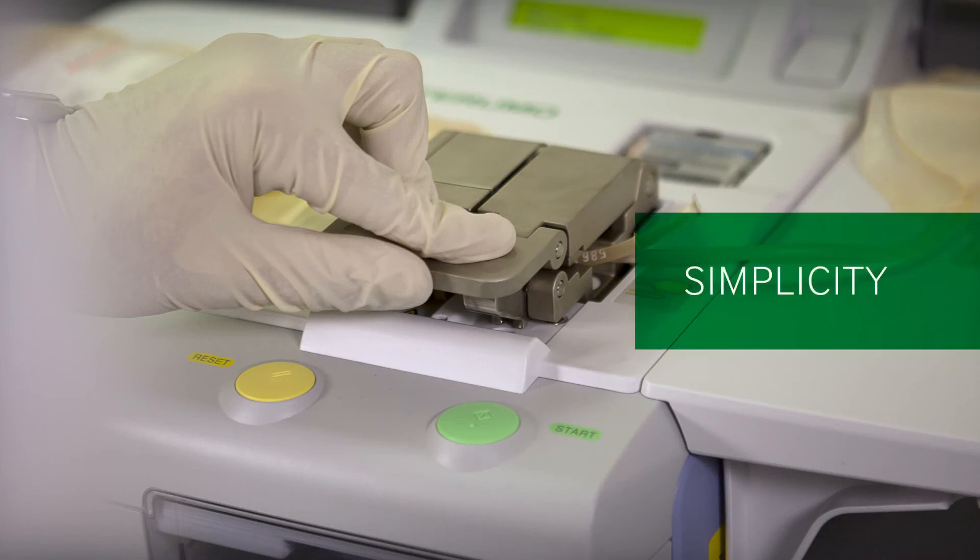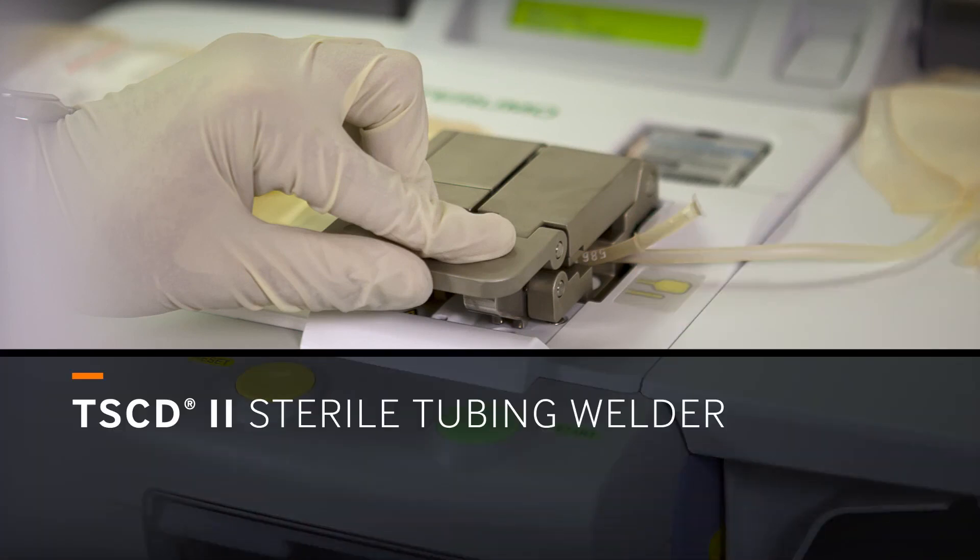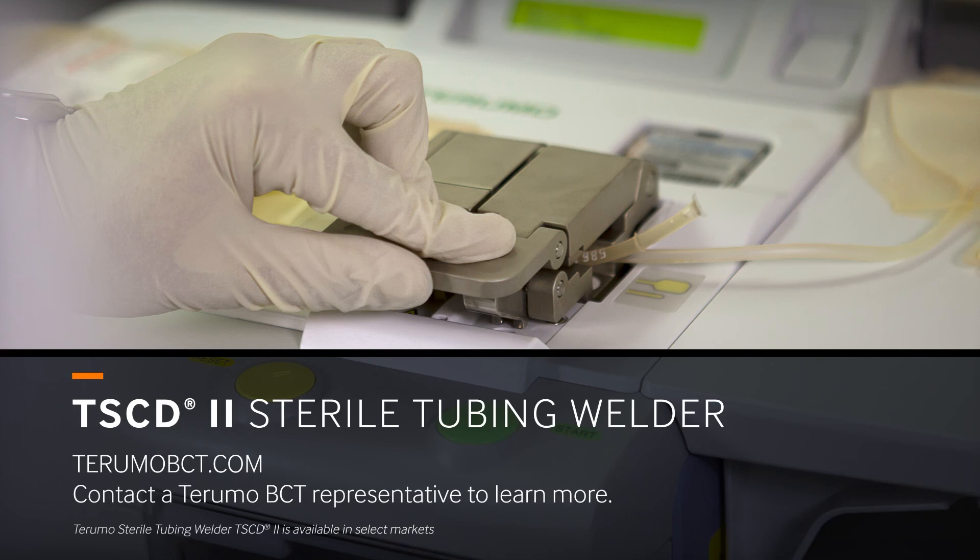Versatility, simplicity and sterility make the TS-CD2 welder the ideal choice for a wide range of lab applications. Contact your Terumo BCT representative to learn more.